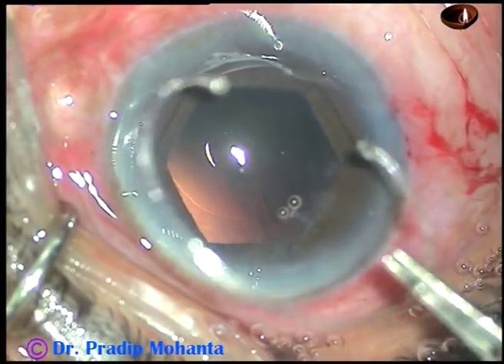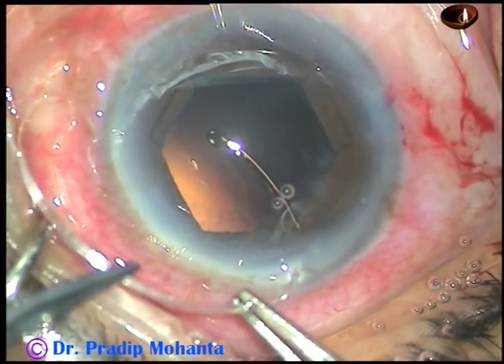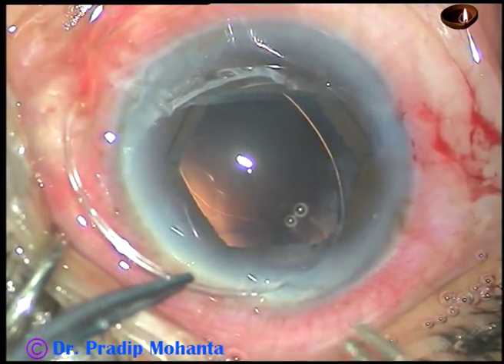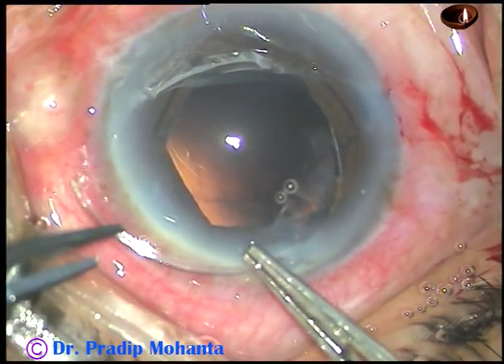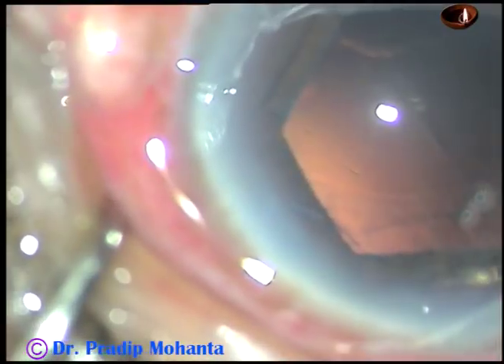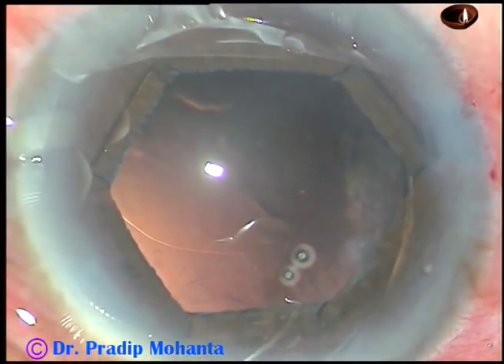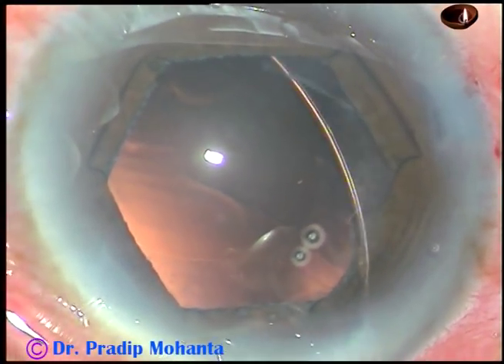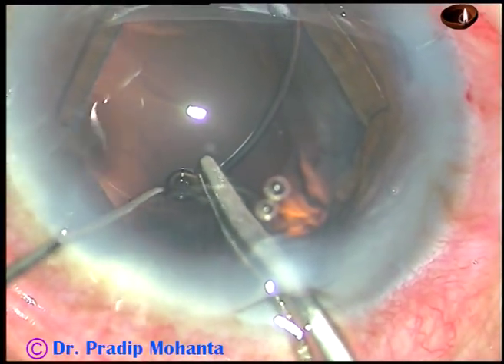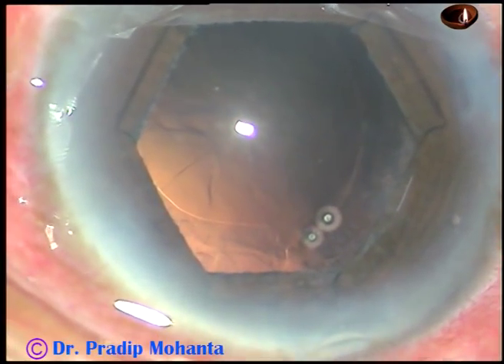Viscoelastic substance is injected, and this is a CTR to support the bag. The leading end of the CTR goes into the capsular bag. I have a McPherson's in my right hand and a forceps in my left hand, feeding it into the capsular bag. I then take the McPherson's in my right hand and the Szynski hook in my left hand, hold it very close to the trailing end, go into the anterior chamber, introduce the Simcoe through the side port, go at a deeper plane, and the CTR goes into the capsular bag.